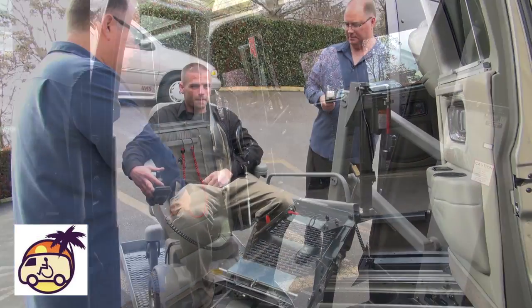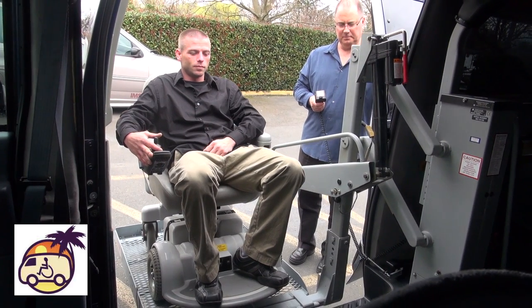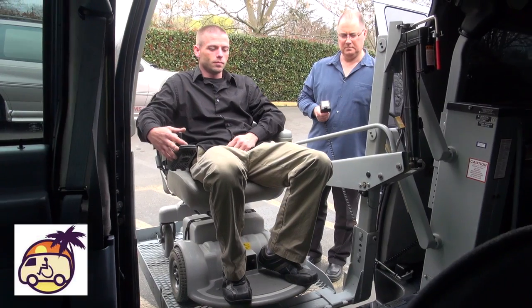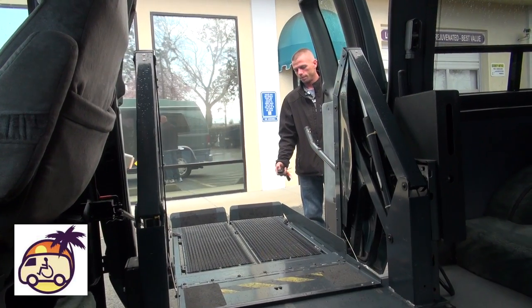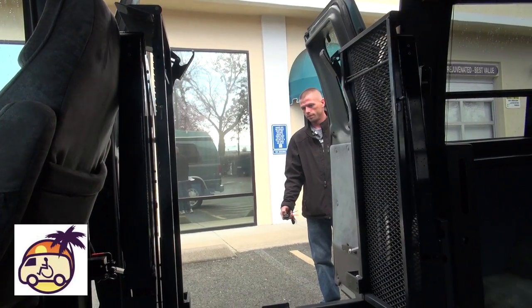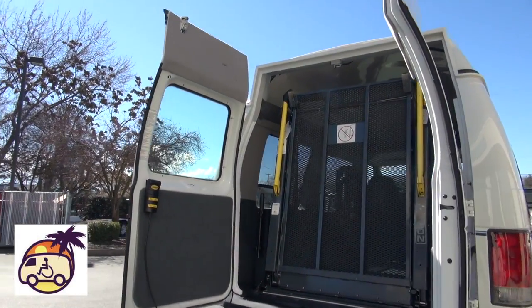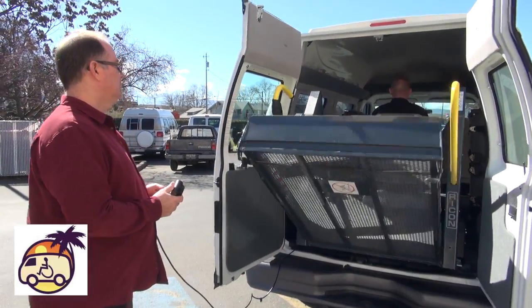The lifts you'll find in full-size vans have two distinctly different styles, and each style has a different capacity. Some have folding platforms that fold partially in order to allow able-bodied folks to go in and out of the van when the lift is stowed. The other style has solid platforms that block the doorway when they're stowed. These different styles of lifts have different weight capacities. I will also mention that the platforms vary in length and width, and you want to be aware of that when van shopping, especially if you have a very large wheelchair.